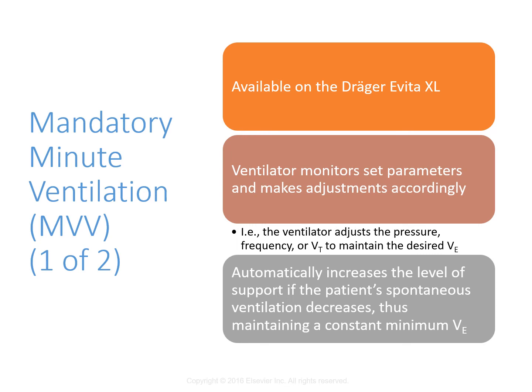So potential benefits are pretty strong when we're looking at this, but there's not a lot of clinical studies that use MMV as a weaning technique. So a lot of times this was used as a regular mode and not as a weaning mode. So keep that in mind.